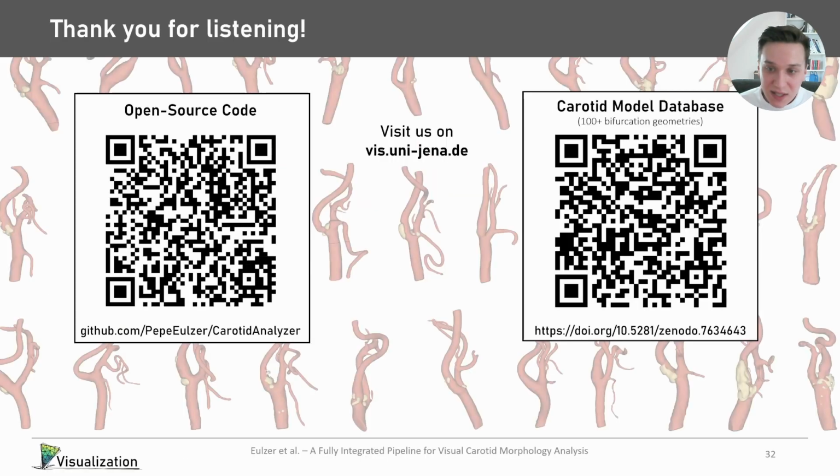For anyone interested, this carotid model database, we also made it available online. So you can go and use the models yourself, and you can also find here the carotid analyzer source code. And you can use the code to implement extensions for yourself as pipeline modules.